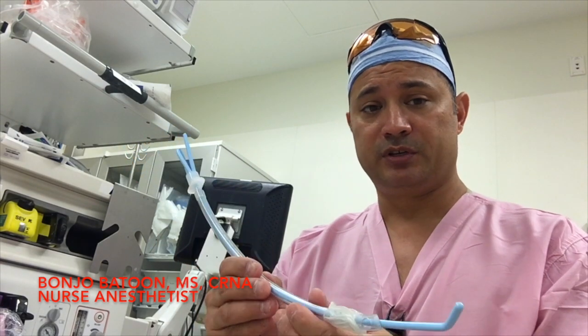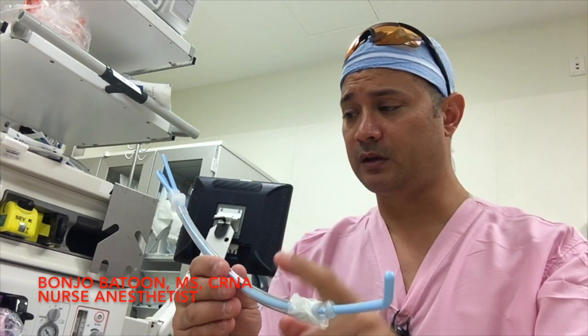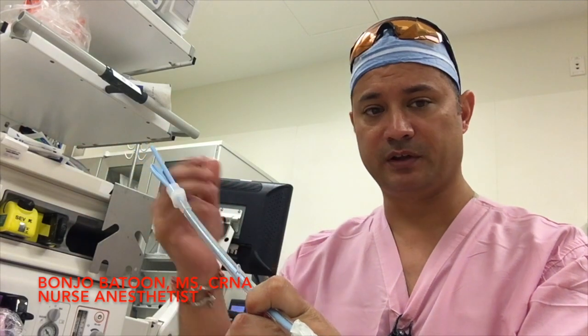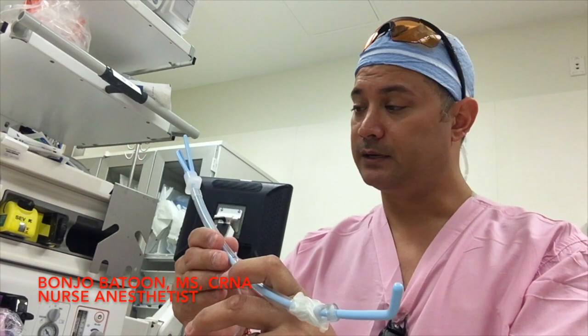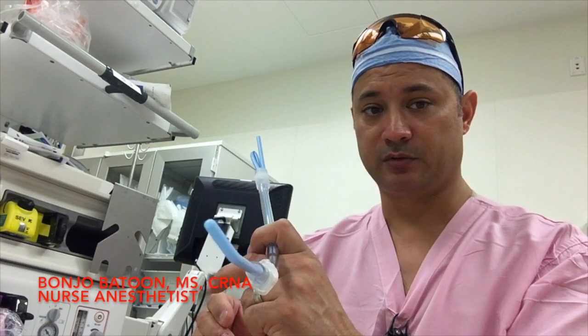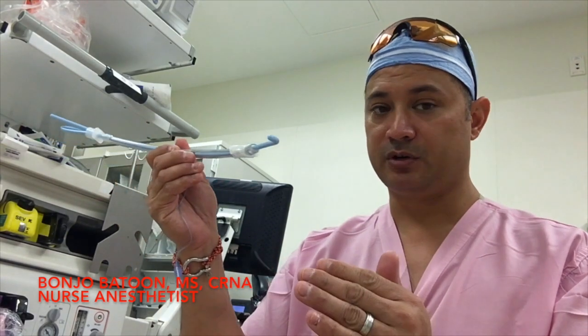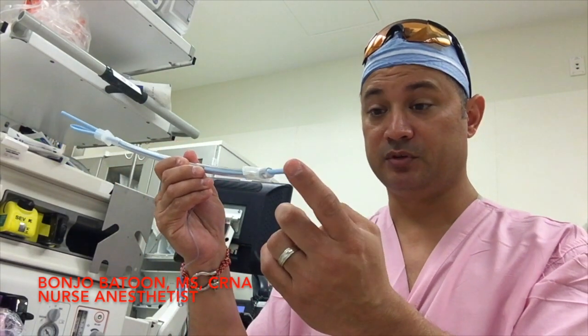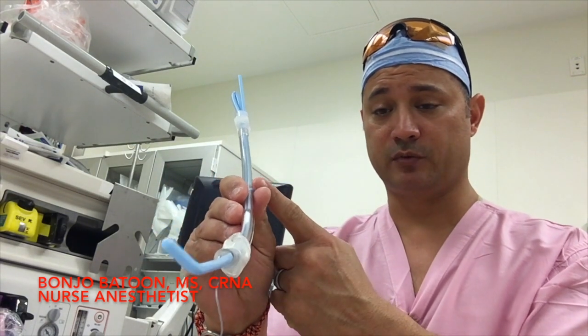With bougies generally, what you do is perform a direct laryngoscopy, take your bougie, slide it over, and an assistant or somebody else slides the ET tube over the bougie, and then you pass your ET tube through. With this technique, it's truly a one-person technique where you put in your styletted ET tube into the vocal cords and slide your tube down exactly where you need it.